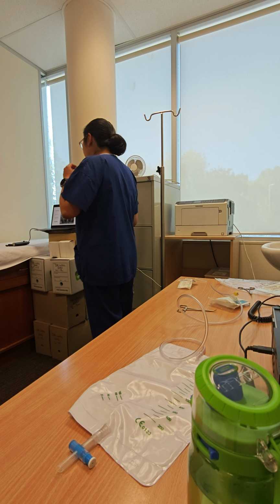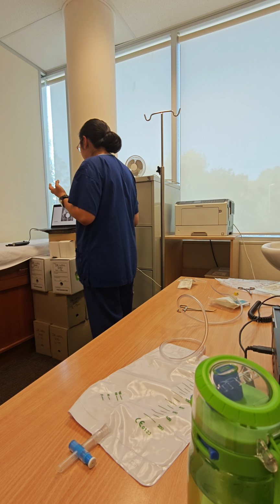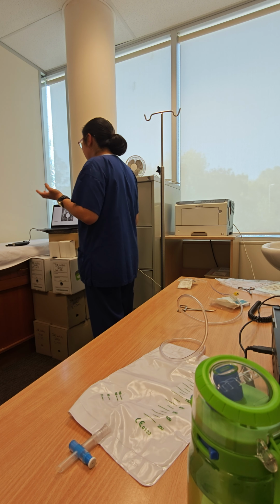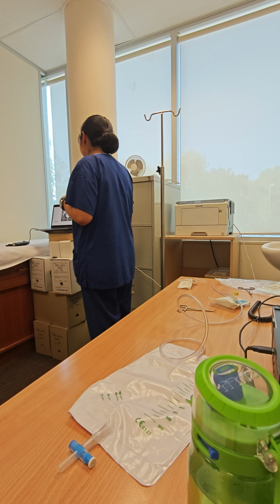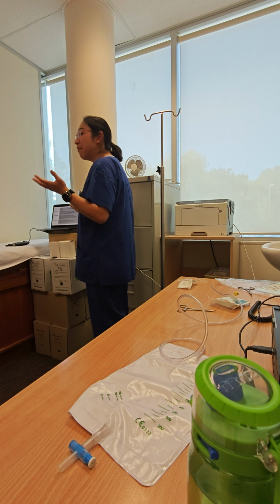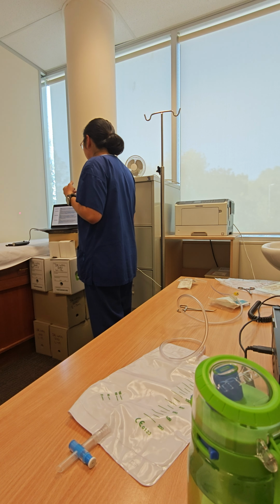Then it comes to the fourth time. Finally, what happened here? We can see there's no leaking, no contrast detected under the bladder. It's only surgical clips around the prostate area. That means the leak is healed. Well done. Oh, good. Let's have a look at what our doctor wrote in their report.